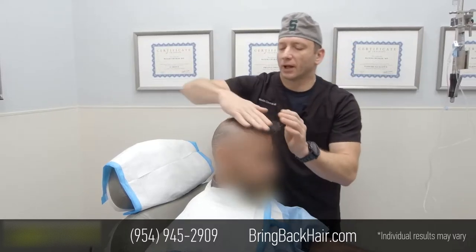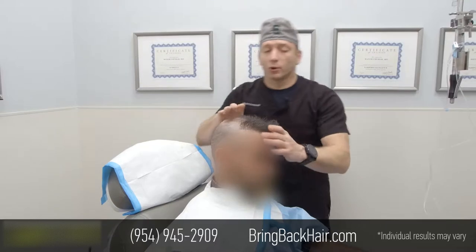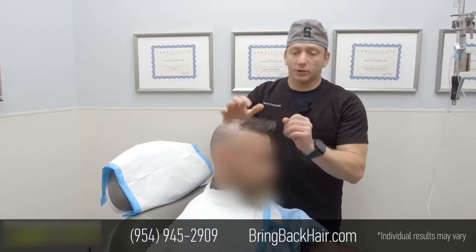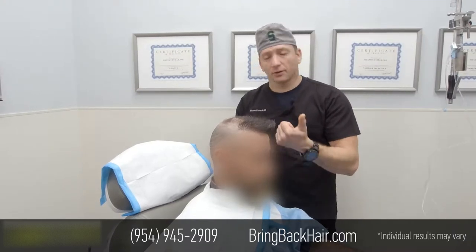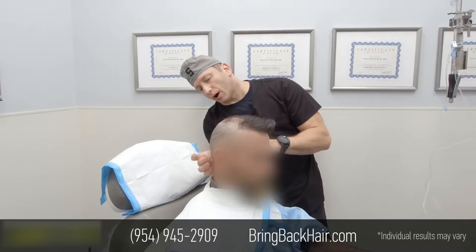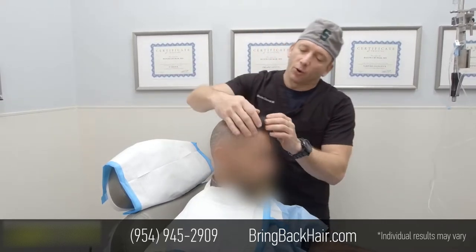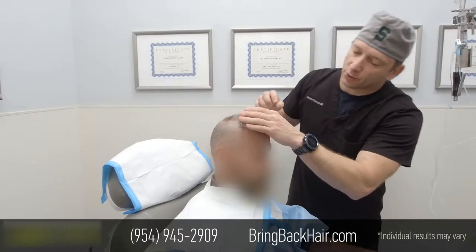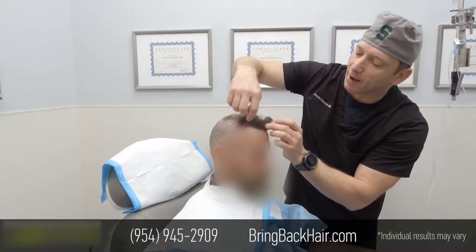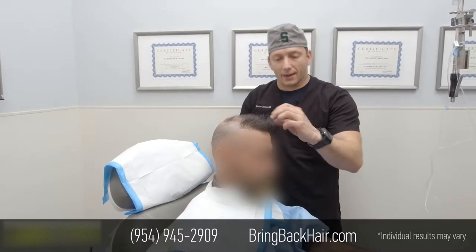So what are we doing today? We're going to create a naturally looking hairline utilizing robotic harvesting and some manual harvesting at the bottom, as the patient requested. My goal today would be to create an irregular hairline and blend those grafts inside so at the end it will appear natural.